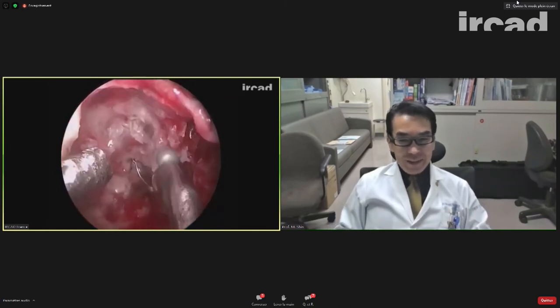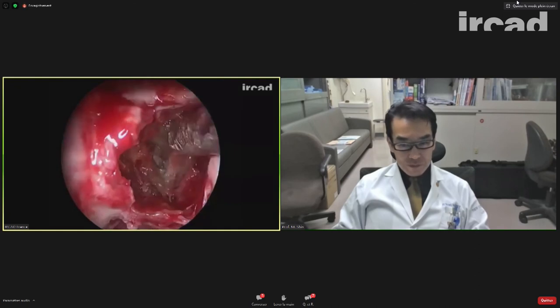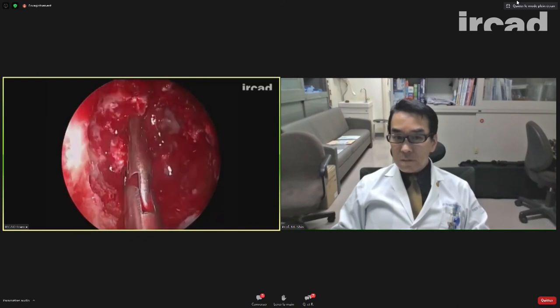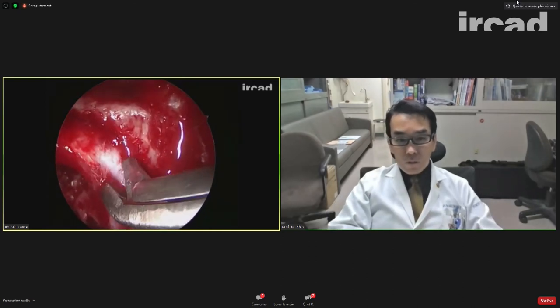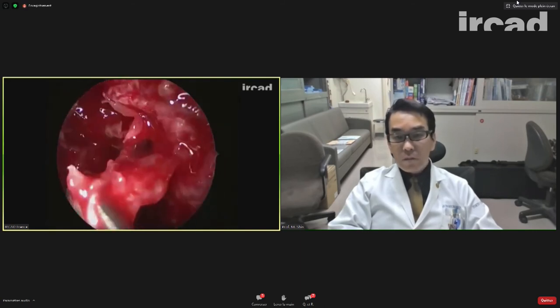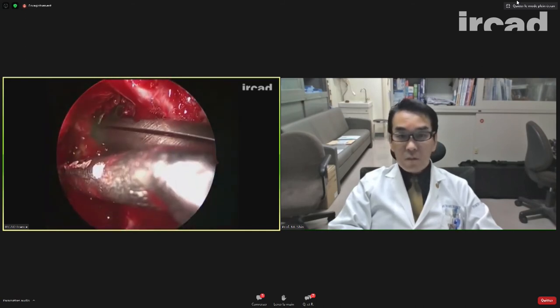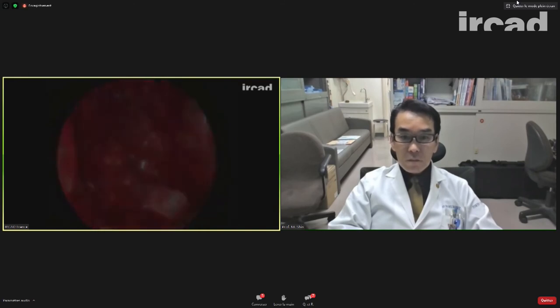So here is the sphenoid sinus, exposing the carotid artery, getting into the cavernous sinus, and the tumor was not as soft as expected. In fact, it was a little bit more fibrous than I would have expected, because it was very hyper T2 on the MRI. But in fact, it was a little bit fibrous with some calcification inside. So less favorable than expected for resection. But we achieved a nice resection of the part of the tumor inside the cavernous sinus. Obviously, you have bleeding at the end, which is a good sign, because it means that you have decompressed the cavernous sinus. If you don't have venous bleeding, usually it means that you left some tumor behind.